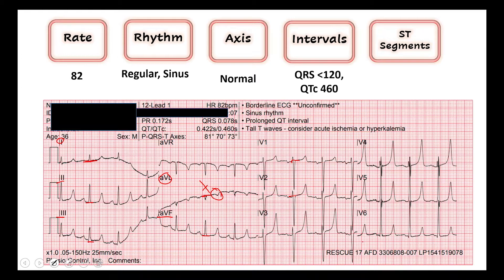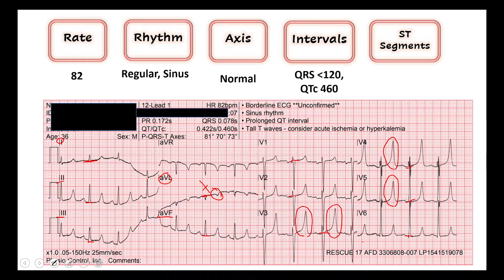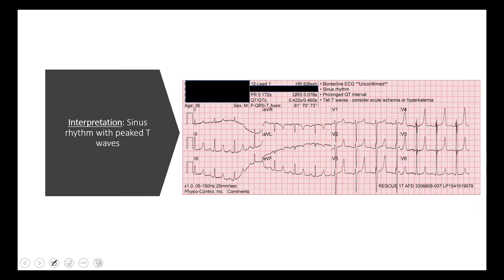In the anterior leads, pretty close to the baseline — maybe about one box of elevation in V3, and you're allowed to have that. In V2 and V3, to count for a STEMI equivalent you need two boxes of elevation with reciprocal changes, and we know there are no reciprocal changes. One millimeter of elevation is acceptable. We don't see any in the other leads, no inverted T waves or anything concerning. But something does stick out: a very large, very spiky T wave that goes all the way across the precordium, coming up to a really high point with lots of energy. This is very concerning for hyperkalemia.